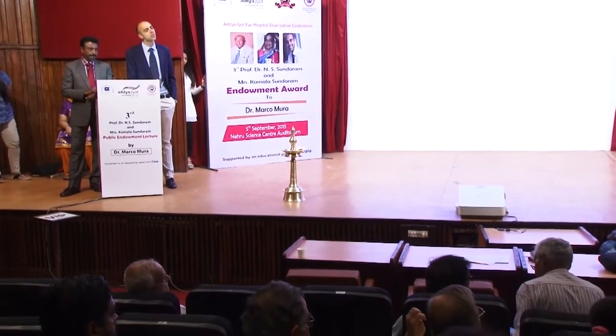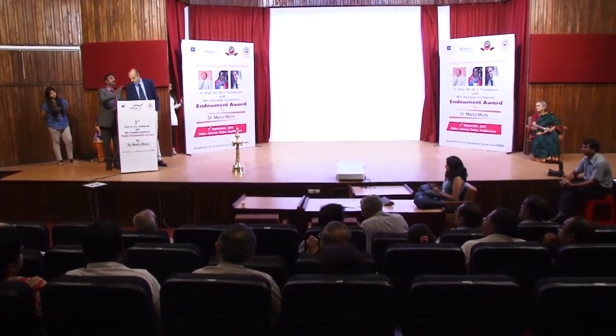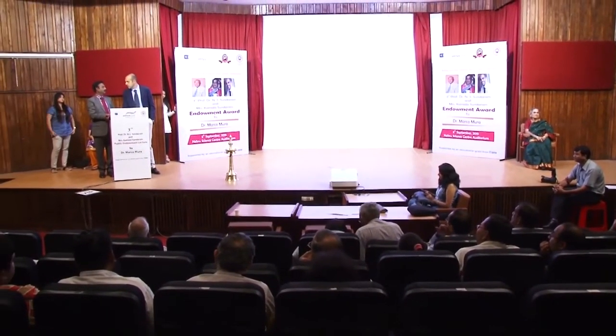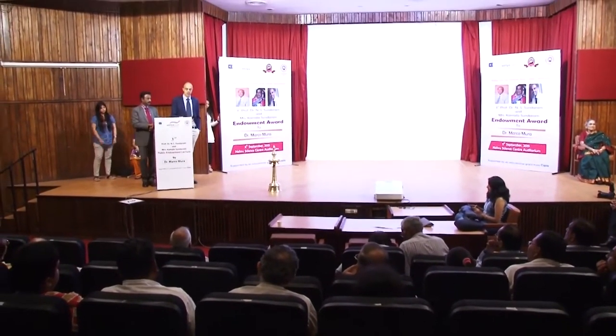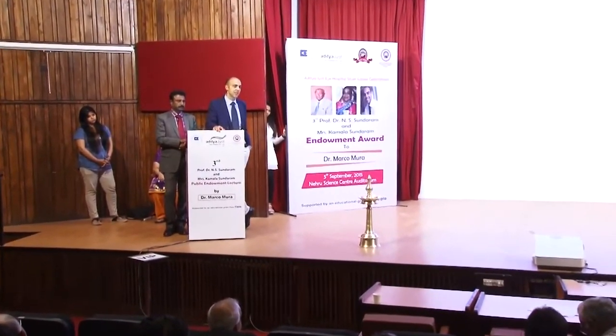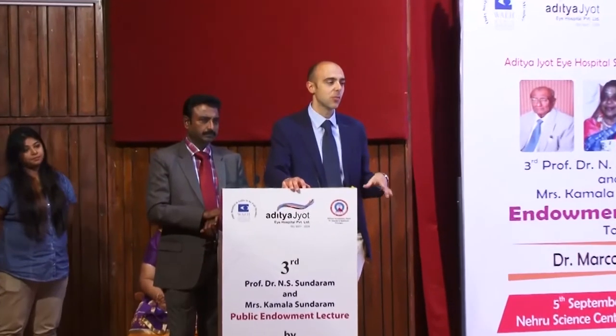Could you describe the image stimulation where the patient has to train? About what you said after the implant, the vision stimulation by the rehabilitation and the psychologist. How can you do that? There are some tasks that they have to learn to do. There is a specialist in low vision who tells them what to do, because you basically lose the coordination between your hands and your eyes once you are blind. And then when the camera comes, you have it again, but it was only one eye in the middle. So the coordination between the single eye in the middle and the hands is different than with both eyes. That has to be retrained.